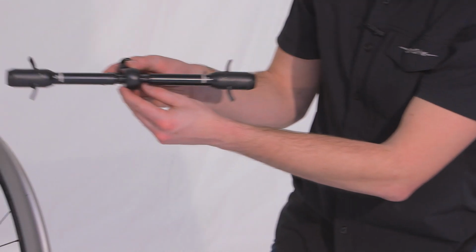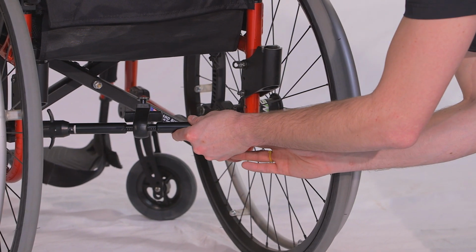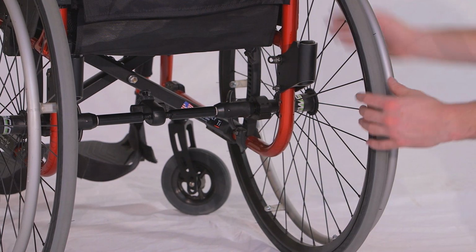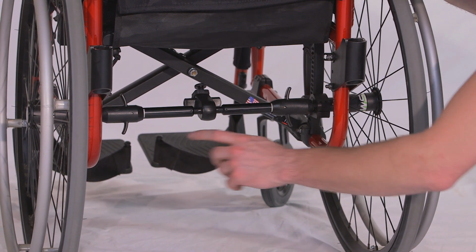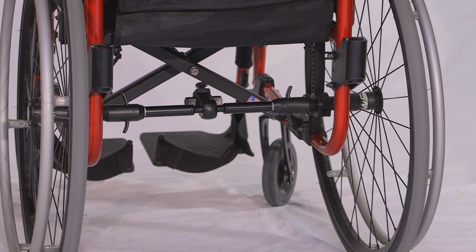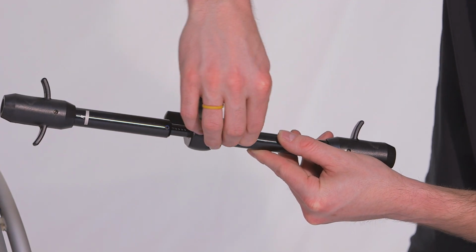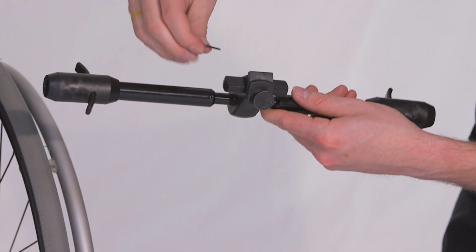Now, you'll want to double check to make sure it is set up correctly. To do this, place one end cap over the tip of one of the axles. Grabbing the tab on the other end cap, compress the springs inside the bar and place it over the opposite axle tip. If set up correctly, the inside edges of the end caps will be positioned over the white stripes of the tubes. If they aren't, adjust the number of dimples visible as needed to achieve the proper spring preload setting. Otherwise, you will run the risk of having your SmartDrive come off during use.